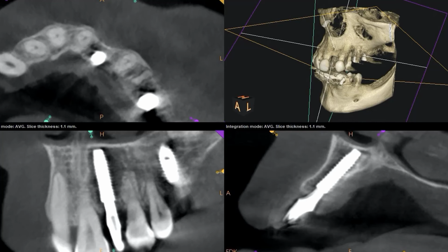It is a little deep in the bone, but that's how deep it had to be in order to get bone around the lingual. It was a little bit thinner, and since augmentation was not in the cards for this patient, we were forced to put the implant a little bit deeper just so I could get good bone coverage 360 degrees around the implant. And that lingual side has a little bit of a concavity there that just made it a little bit harder to get bone coverage. So that's my thought as far as the outcome of the procedure.